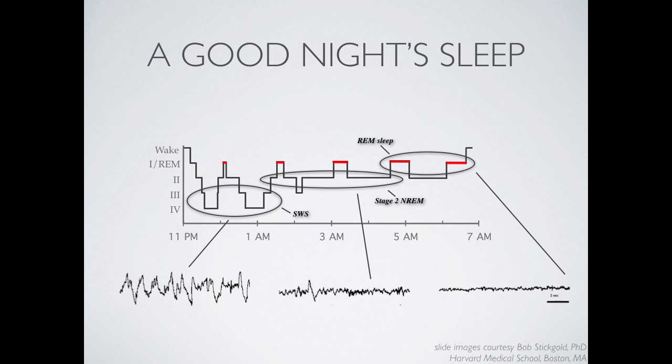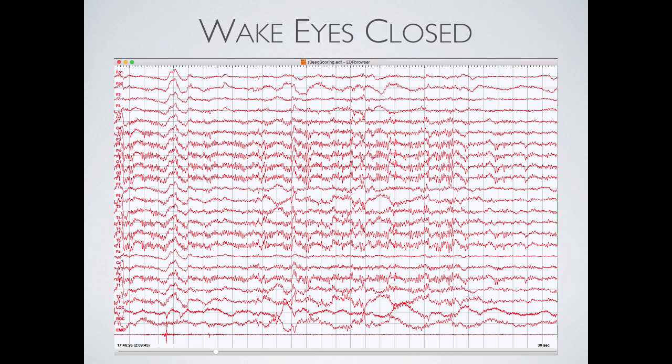The EEG is actually interestingly indistinguishable from the waking EEG. So without those other signals we talked about, the eye movements and the muscle tone, it's absolutely indistinguishable if you're looking at a brain that's dreaming and a brain that's 100% awake, which was something when I was an undergrad I thought was really, really neat. Just quickly, what these signals look like.